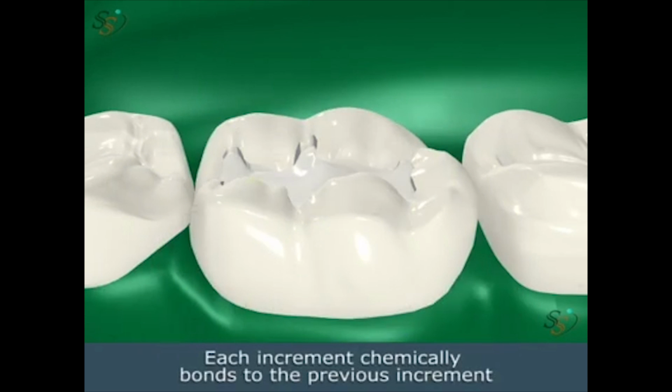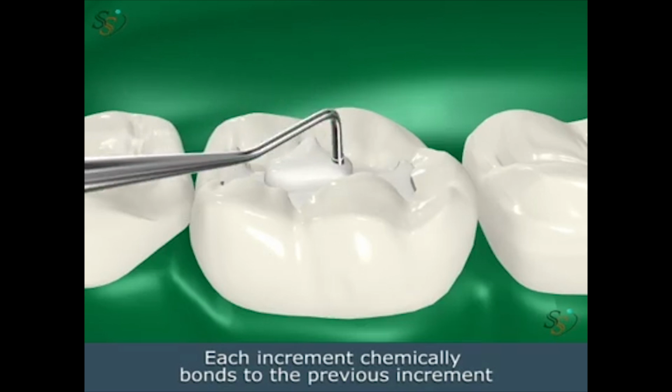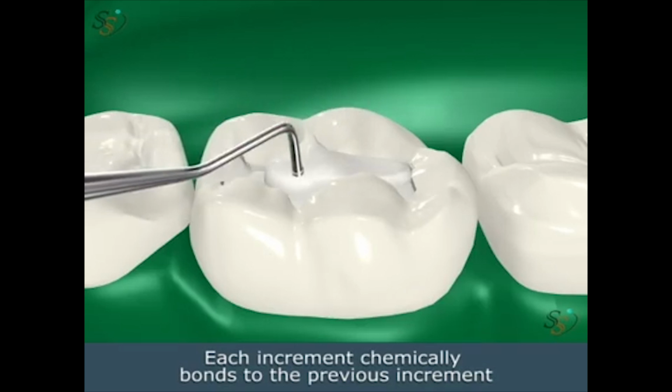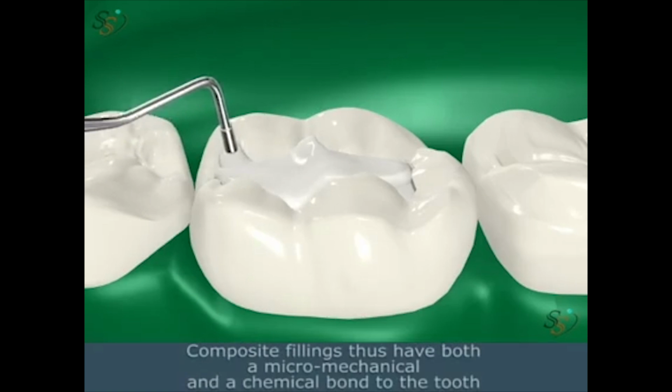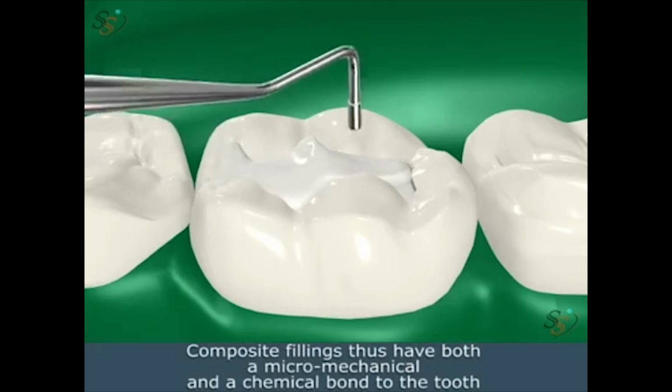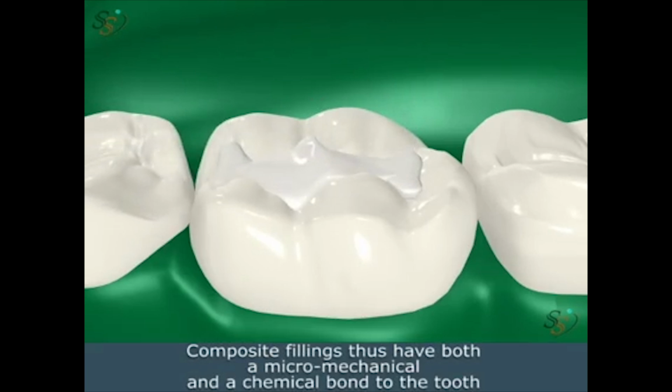Each increment chemically bonds to the previous increment. Composite fillings have both a micromechanical and chemical bond to the tooth to ensure its strength and durability.